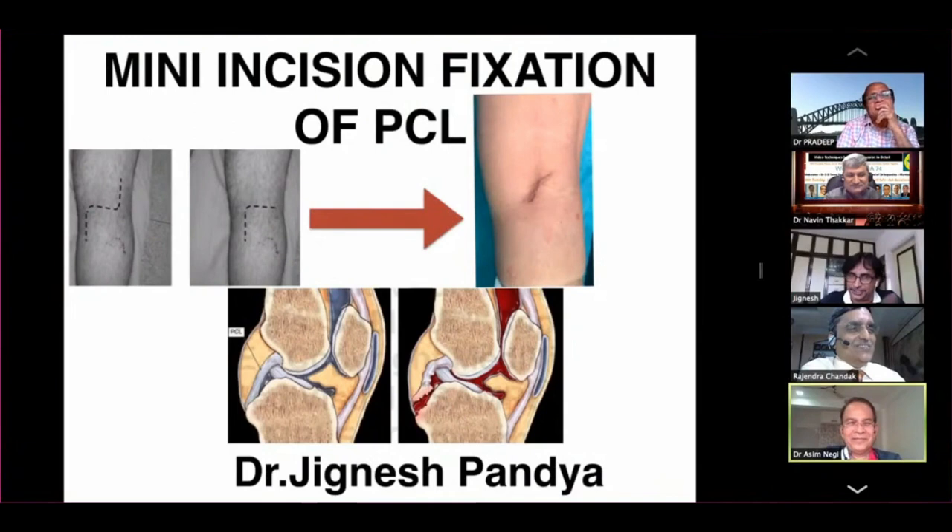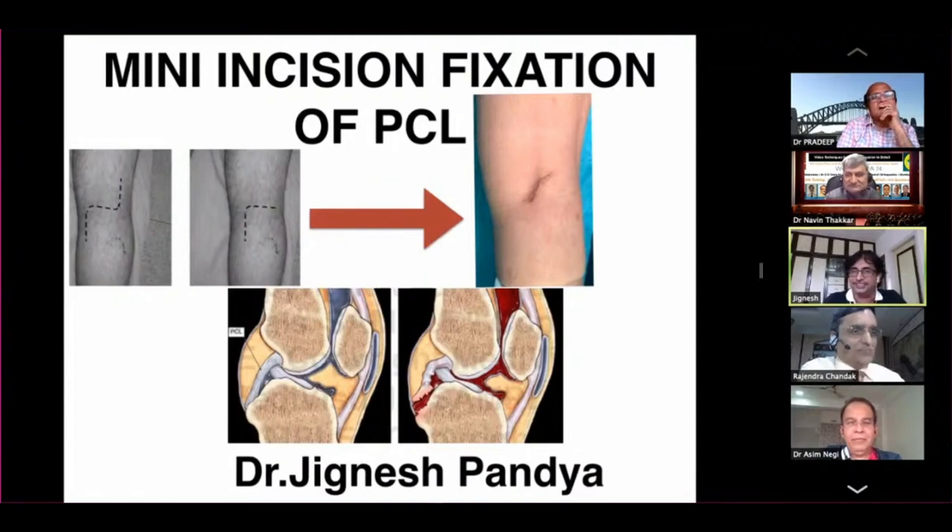This is a small procedure of mini-incision fixation of PCL. If we see the approaches, it started like this on the left side first.